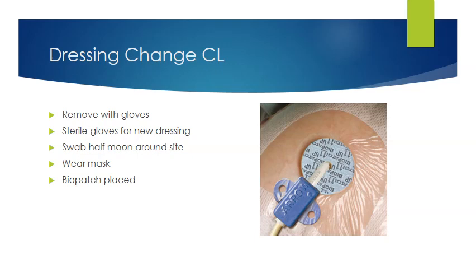That is now best practice, to place a biopatch. This picture on your slide shows the picture of a biopatch, and it's that little blue disc. It actually has a little slit down one side, and it'll just slide right on around that line, and you'll change that every time that you change central line. And there's actually antimicrobials on the bottom side of that disc, and it'll help prevent infection. So that's why we use those.